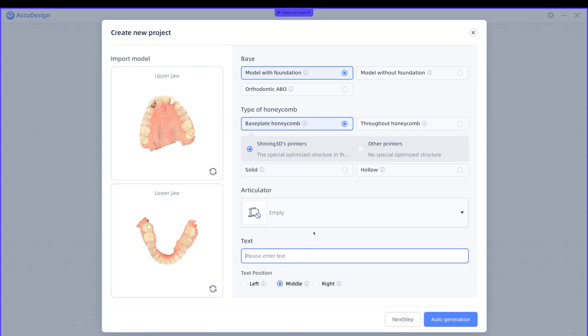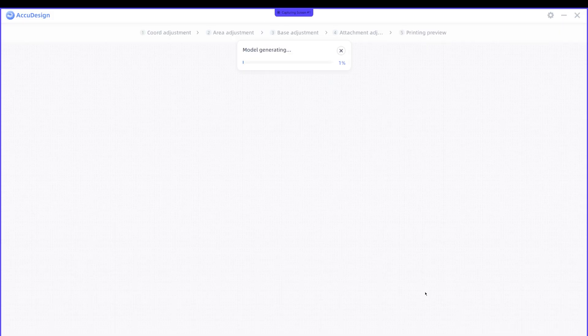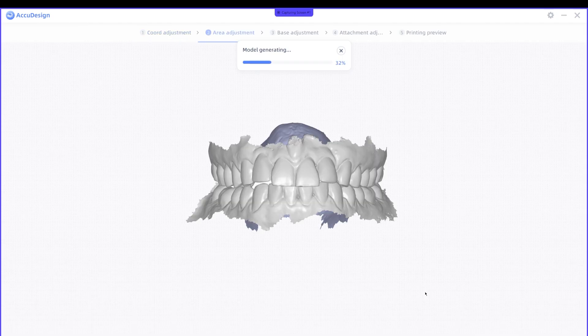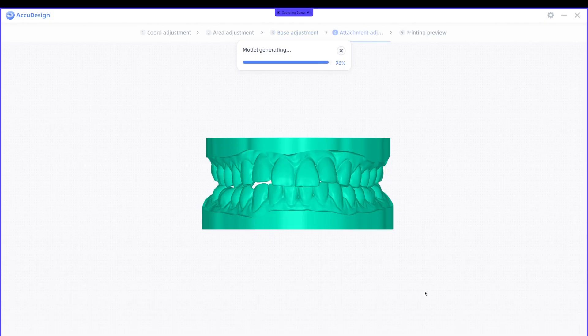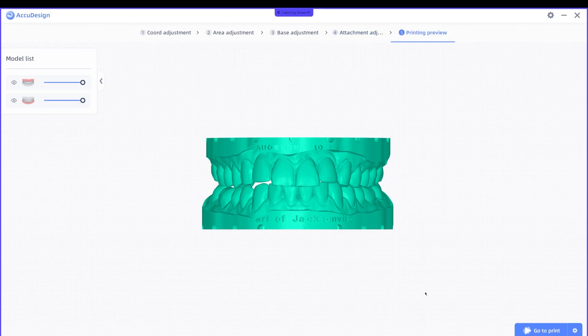I'm going to enter the patient's name, and then I'm going to go to Print.